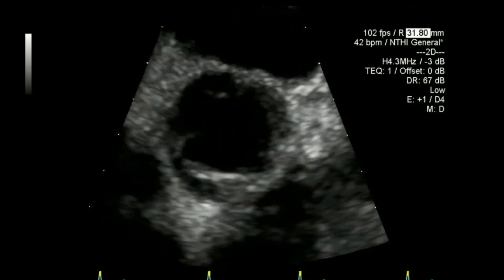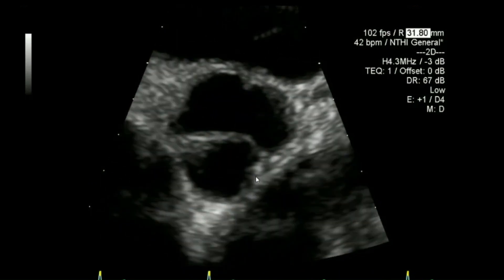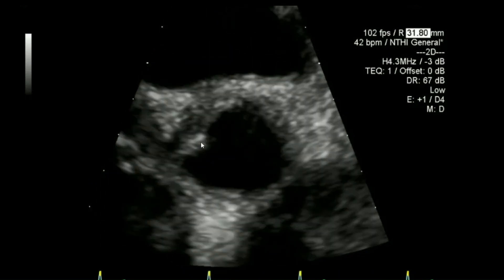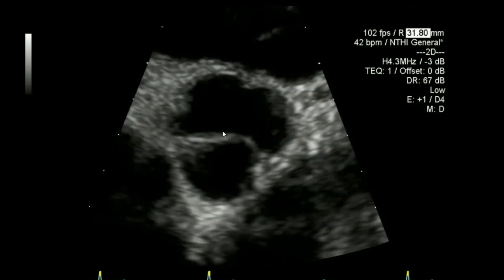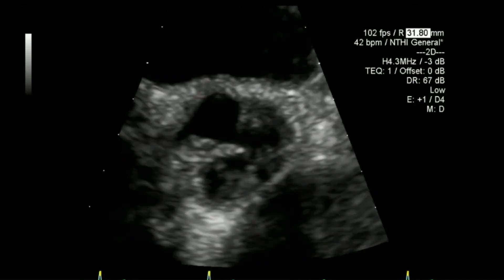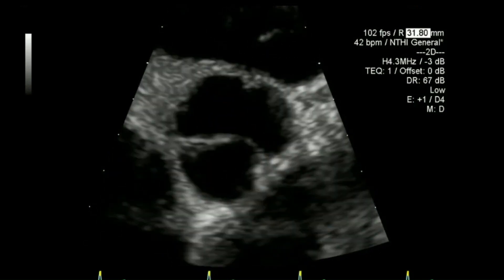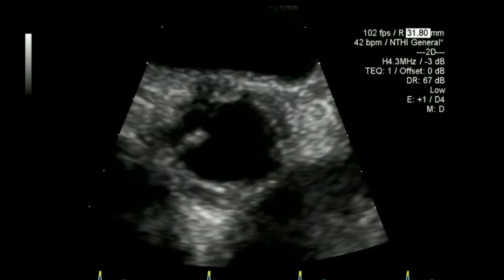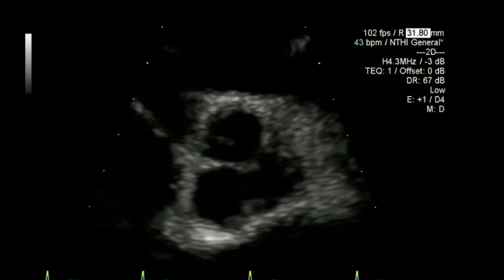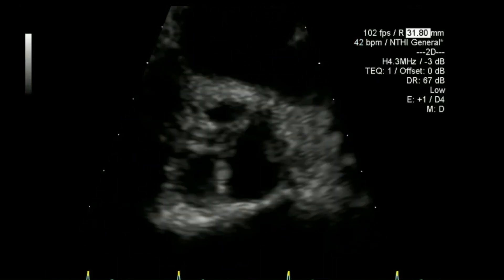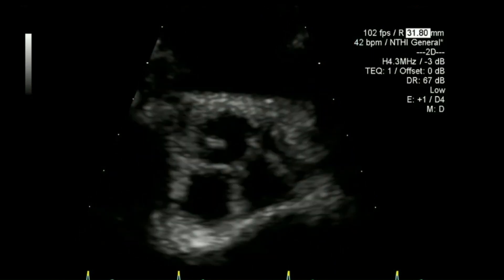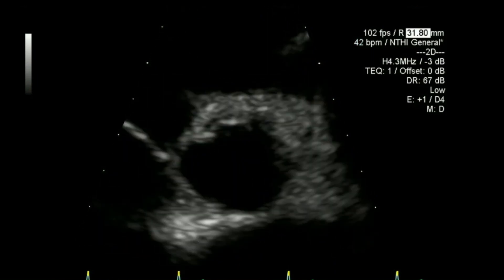I'll zoom on the aortic valve — you can see it is trileaflet and you can just see a little bit of brightness on that proximal portion of the right coronary leaflet. I'll zoom a little bit tighter to focus on what's going on with that leaflet.